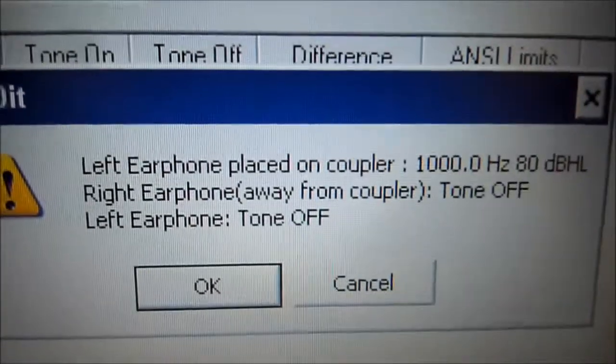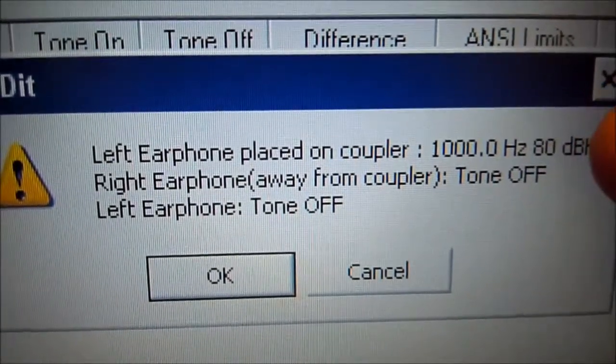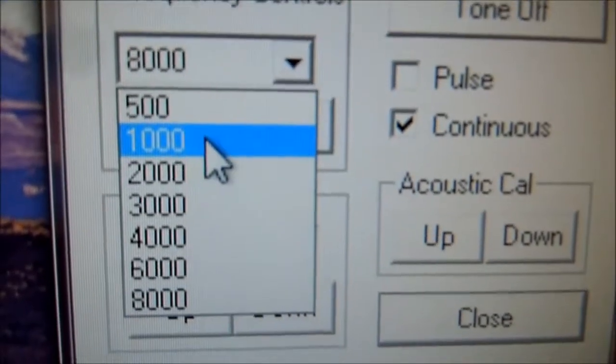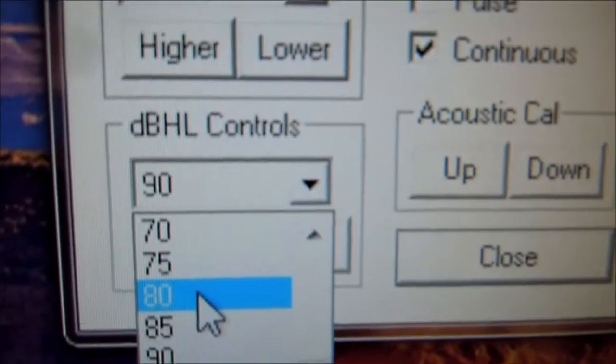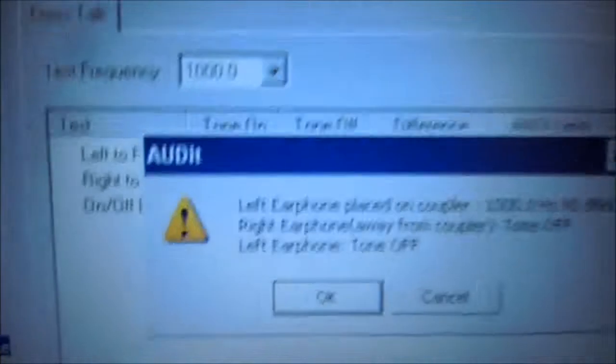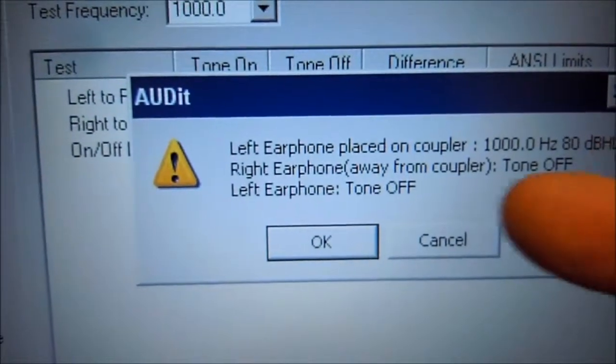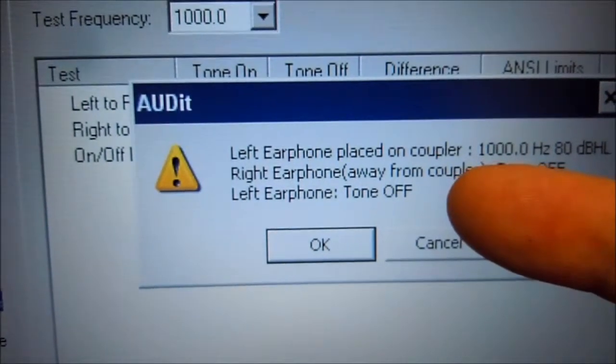Right now we're going to set our left earphone on the coupler, and on the audiometer we're going to set it to 1000 Hz at 80 dB. We're going to change to the left ear — left ear is on. We're going to make sure that the right earphone is away from the coupler, and the right ear is going to be off, and so is the left ear. Right now we don't have a tone on, which is what we want.